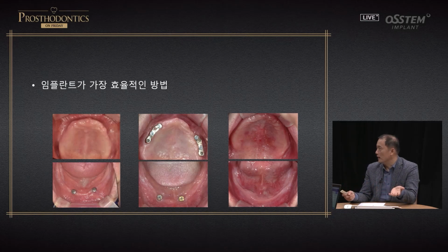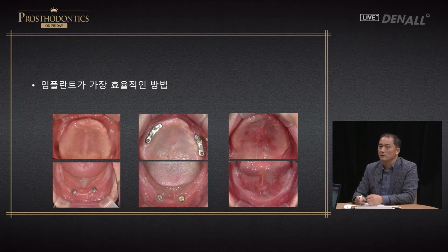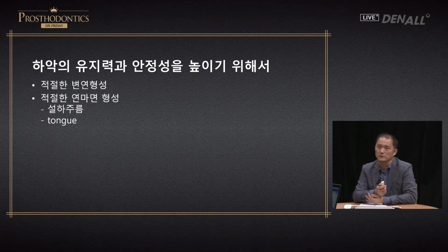If there's no stability and support that you can secure, then you have to use implants. Even if it's a full denture, to gain continuous retention for this type of patient, you need to place implants. Otherwise, it will be very tricky. So you secure support and stability through implant placement.